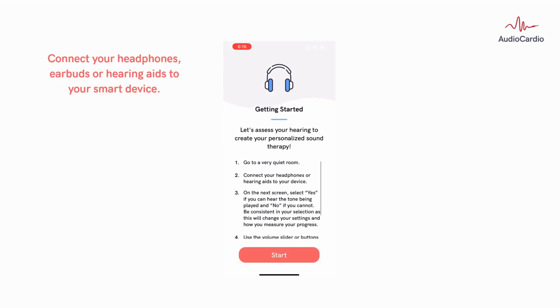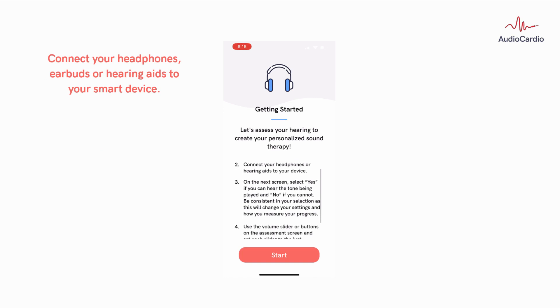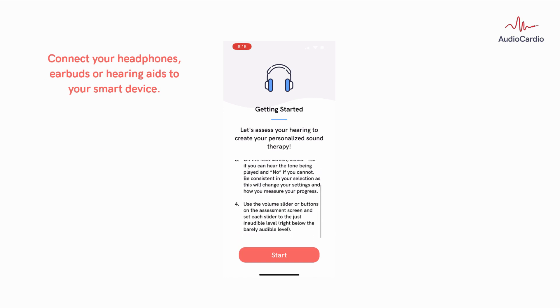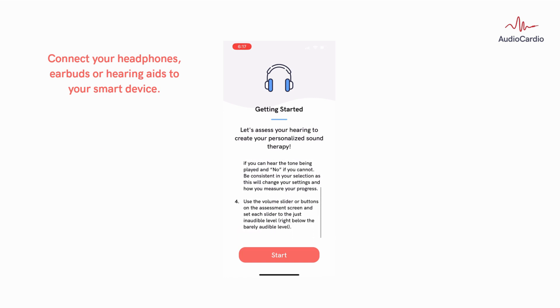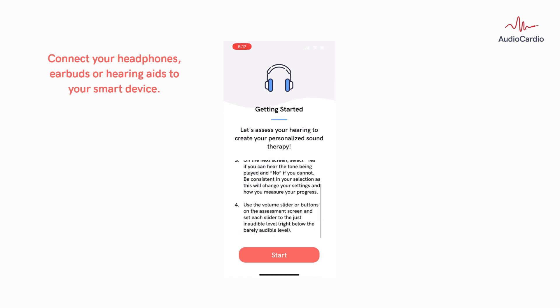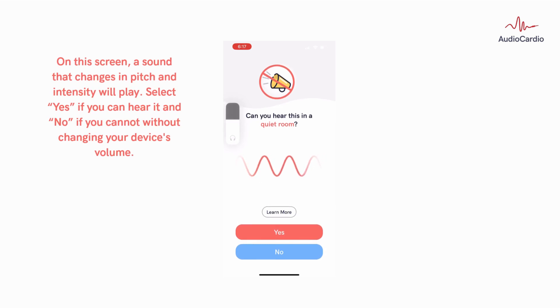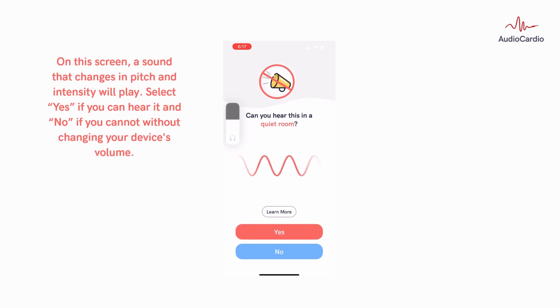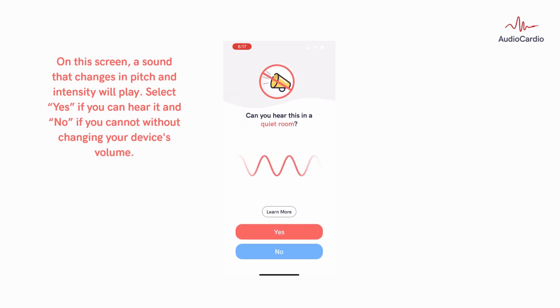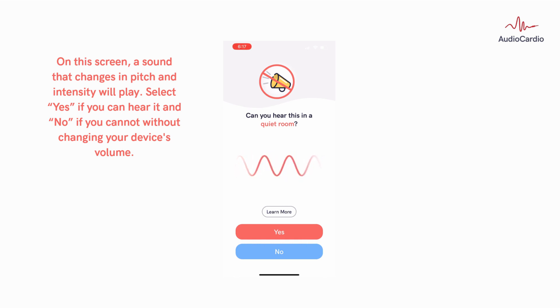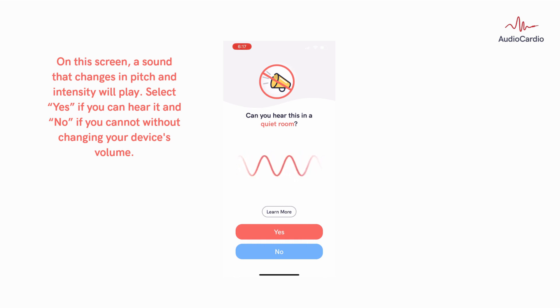Connect your headphones, earbuds, or hearing aids to your smart device. On this screen, a sound that changes in pitch and intensity will play. Select Yes if you can hear it and No if you cannot, without changing your device's volume.